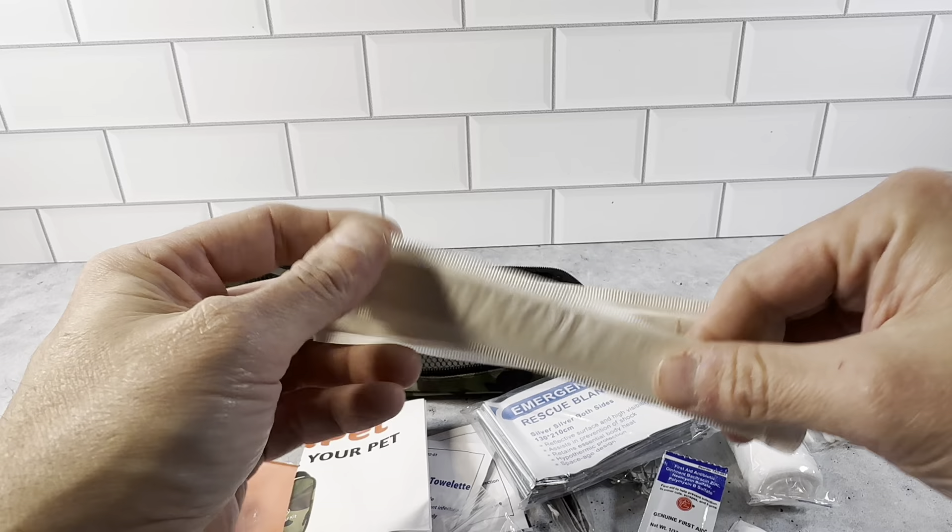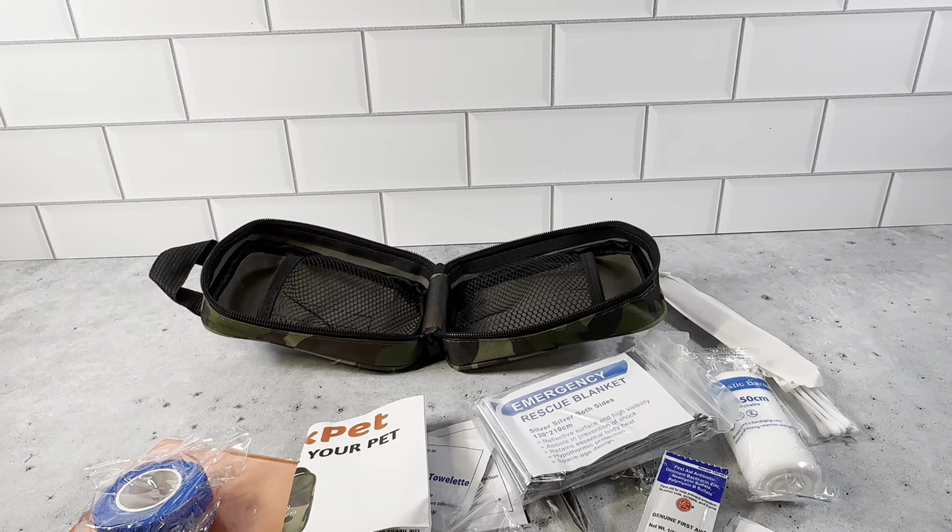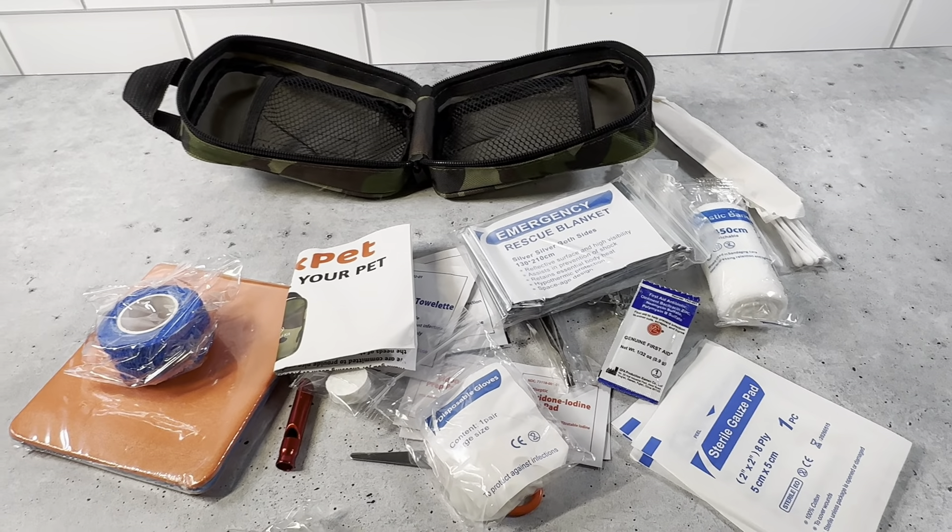The tongue depressors here — two tongue depressors. So you see all of these items here. It's like 47 items in this kit. This is a really nice kit.